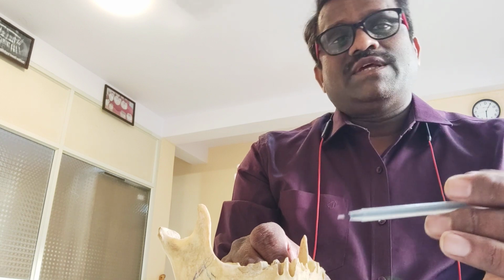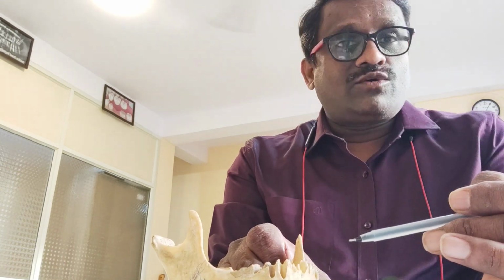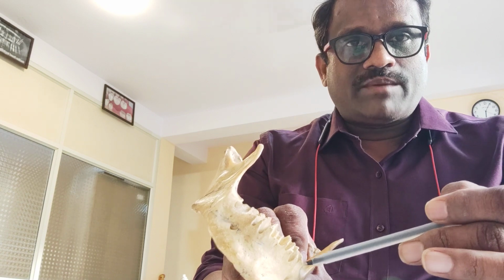Even if there is an atrophied mandible, we can place the implant in the cortical plates with good primary stability and anchorage. The only thing is we have to do the nerve bypass. This is the proper way of bypassing the nerve, and this kind of bypass technique is almost impossible to do with conventional techniques. I have explained in detail how to do narrow bypass. Thank you so much.